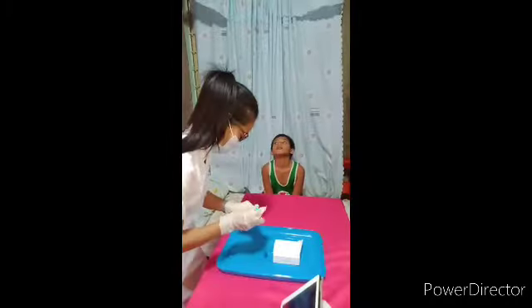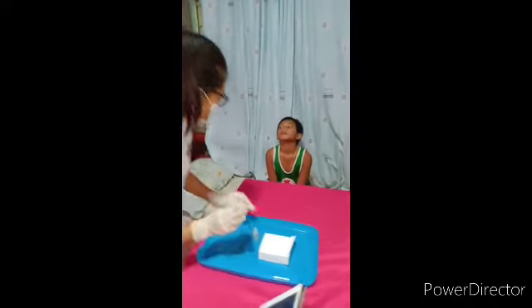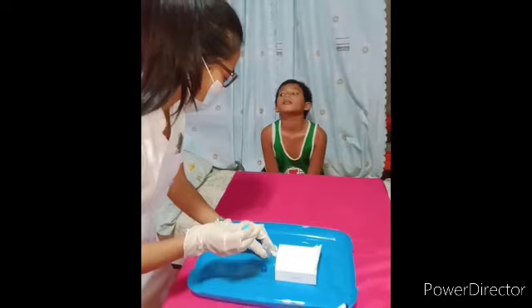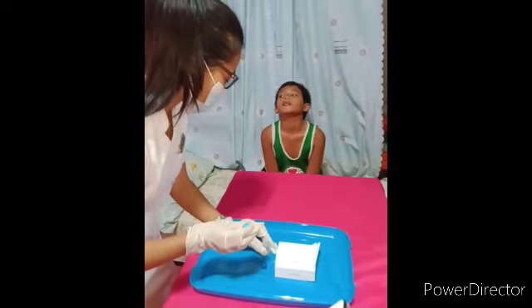Draw sufficient solution into the dropper for both nares. Do not return excess solution to the stock bottle. Returning solution to a stock bottle increases the risk of contamination of the stock bottle.